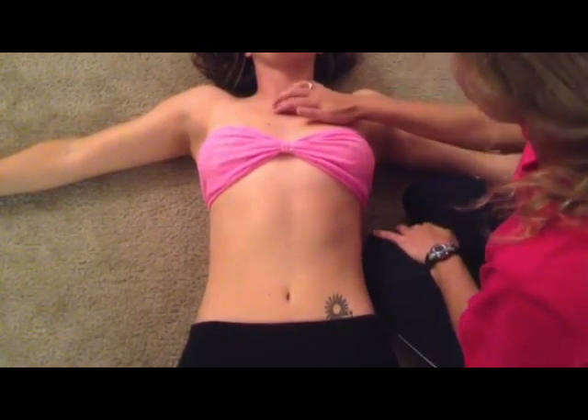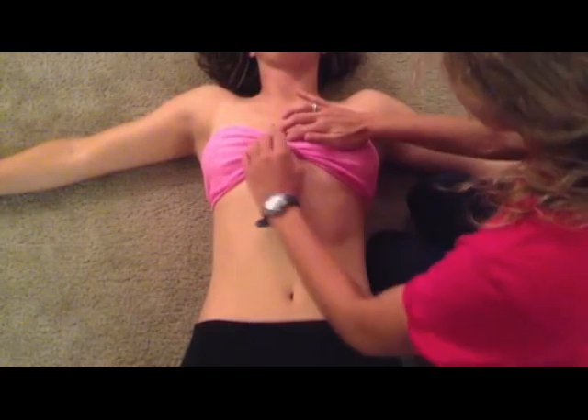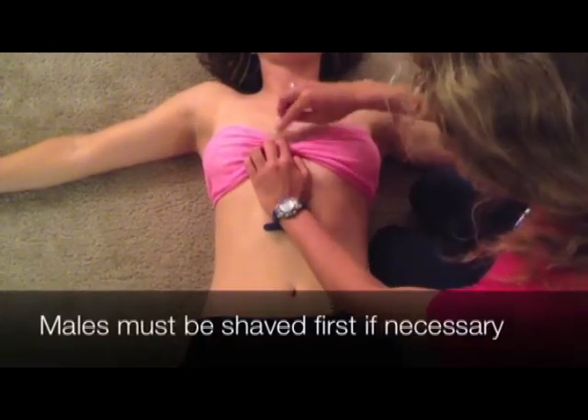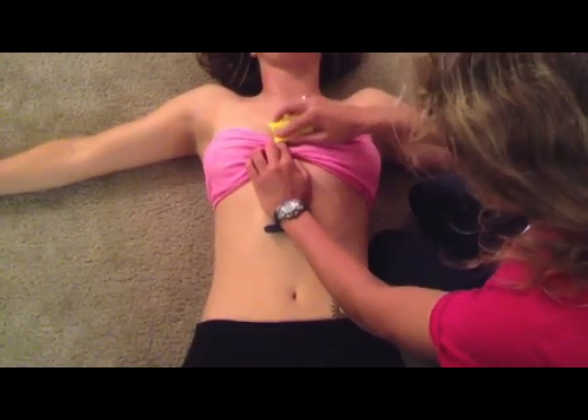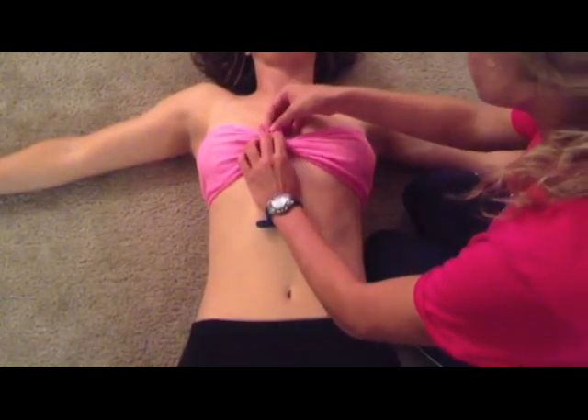We're going to begin by palpating the 4th intercostal space on the right side of the sternum. Clean the area with an alcohol pad, followed by an abrasive pad to remove any extra epidermis and oil on the skin. Then place your first electrode on that spot.